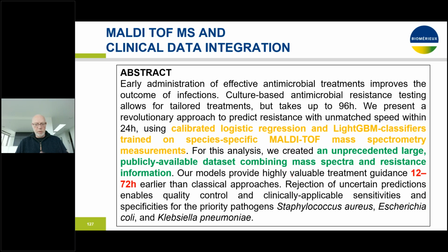I'm looking forward to this particular type of analysis specifically, because if you have all data on patient parameters, on microbiological parameters, on technical parameters, sequencing, MALDI-TOF, and you put that all together into a model that's going to predict whether a bug is virulent, whether it's resistant, whether it's epidemic, based on only a mass spectrum, then that's going to be a spectacular improvement of the mass spec approaches.